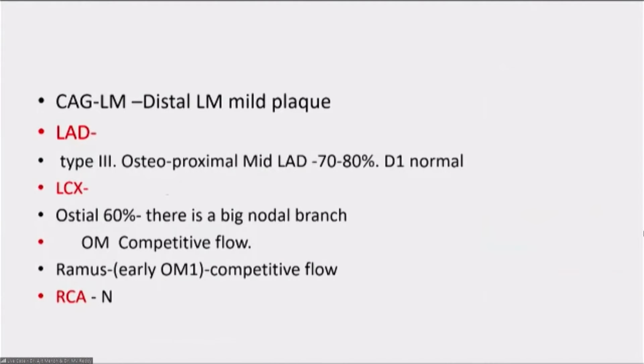There's a little bit of a comedy of errors, because the case we posted to show you developed a fever just an hour ago. So we had to, and our backup case that we had kept also, we finished it off before we could take up the second patient. So this was a completely unplanned patient. We repeated the angiographic views, and we'll just show you the angiographic views here.